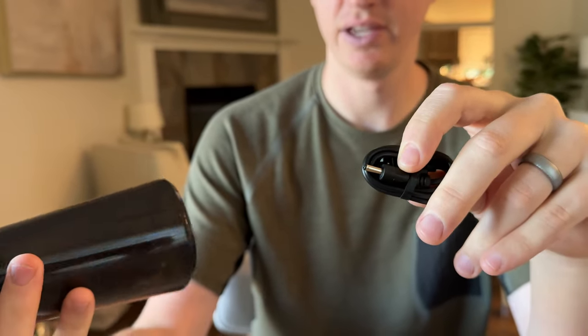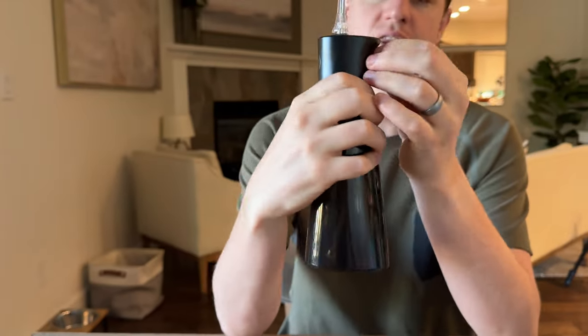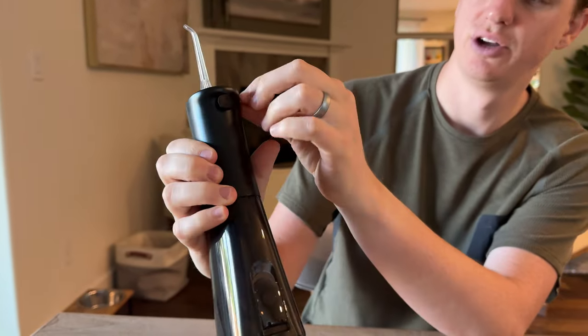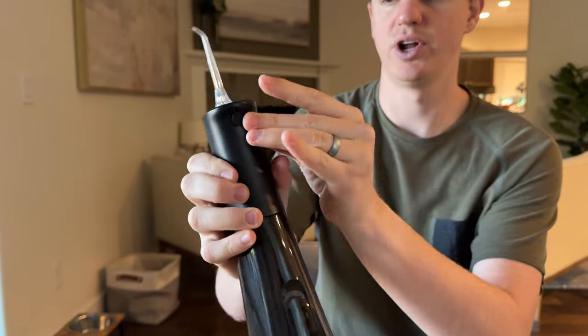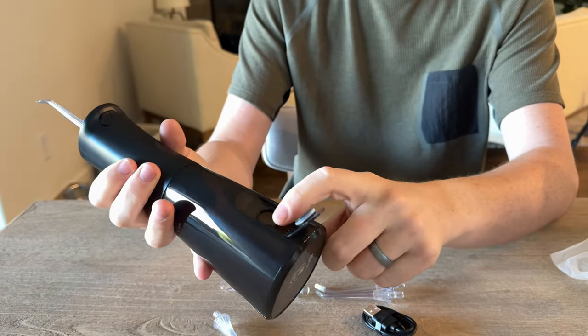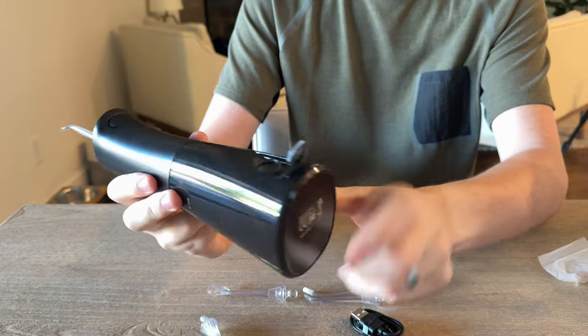In order to charge it, you plug it in on the back — at the very top under the back there's a little rubber gasket that covers the port, so you plug in there to charge it. This is the water container at the bottom, which has a handy refill right here, so you're able to hold it sideways and fill it up.